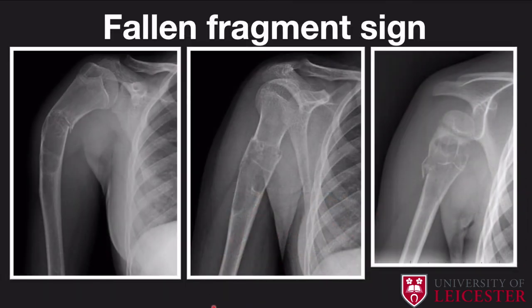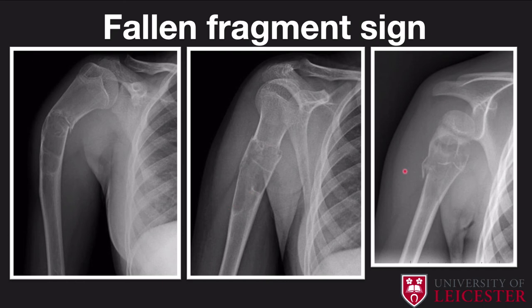Let's talk about the fallen fragment sign. This is an important sign because it indicates a fracture within some sort of pathology — what we call a pathological fracture. Here we have a patient with a simple bone cyst — a unicameral bone cyst — within the proximal humerus. There is a fracture on its superior portion. Specifically, you look for linear areas of high density within the cyst: small fragmented portions that have fallen within the cyst into its dependent portions. This is pathognomonic for a pathological fracture within a simple bone cyst, and is called the fallen fragment sign.